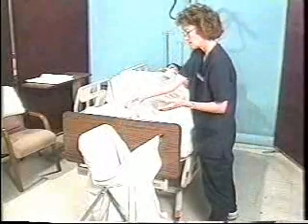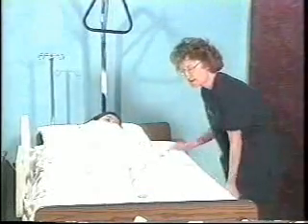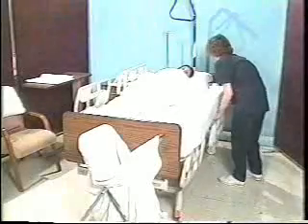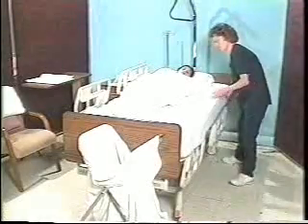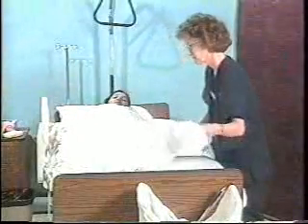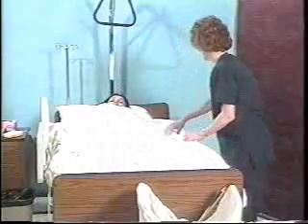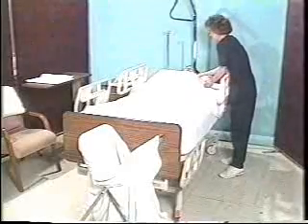Then she discards the soiled gloves and washes her hands after raising the side rail. Next, she puts down the side rail. The mattress pad is then smoothed and the fitted or contour sheet is tucked under the top and bottom corners of the mattress, making sure there are no wrinkles. The incontinence pad is smoothed over the contour sheet. The caregiver has the patient move to the center of the bed. Now she's ready to put on the clean top linens.